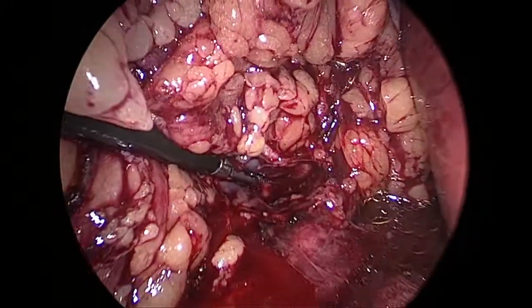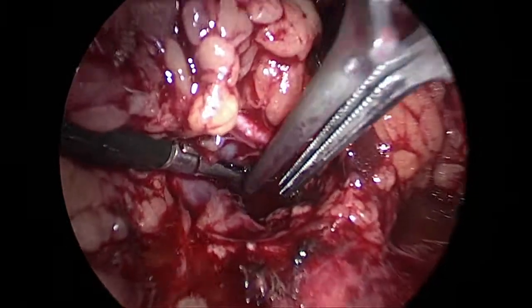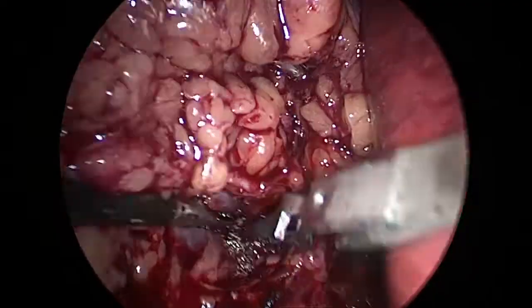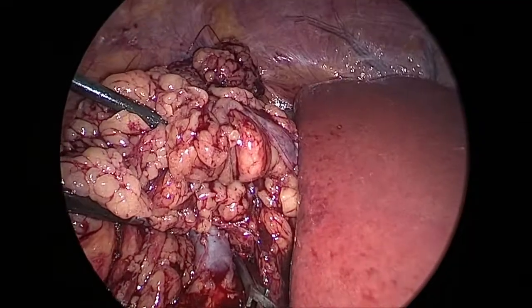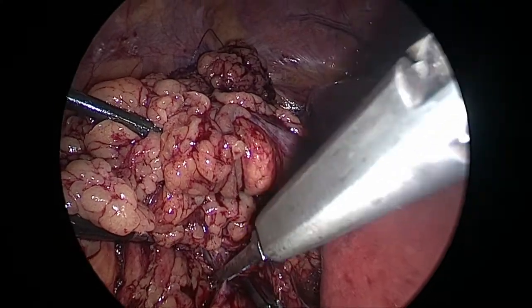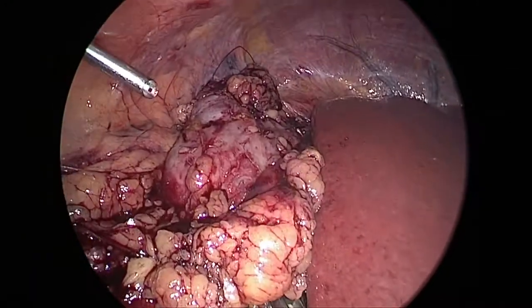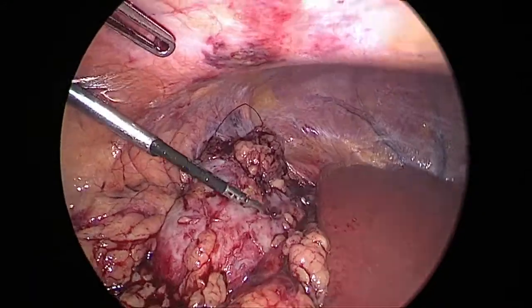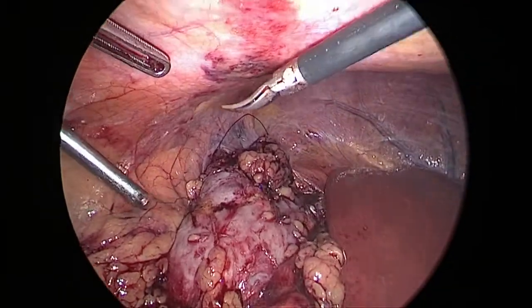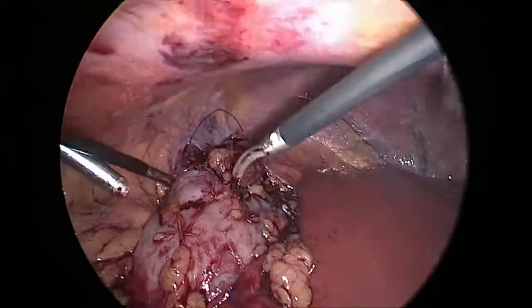Now I will apply the bulldog to both the renal artery and vein. I applied the bulldog to the renal artery, and now I will apply the bulldog to the renal vein. And I am going to start resection of the tumor.